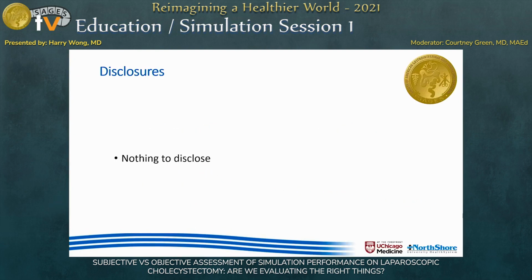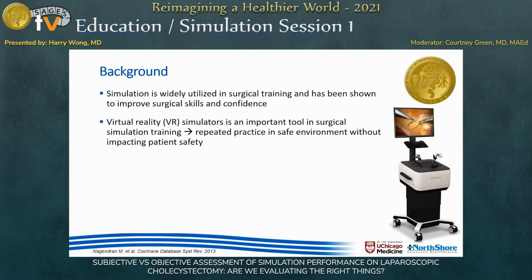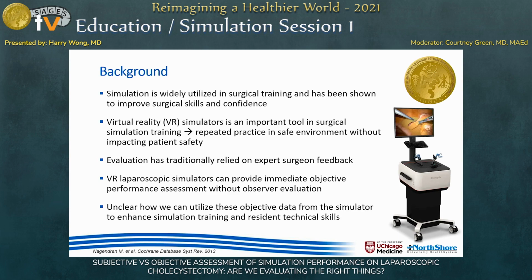I have no disclosures. Simulation is widely utilized in surgical training and has been shown to improve surgical skills and confidence. Virtual reality simulators are an important tool in simulation training, especially for trainees, as they allow repeated practice in a safe environment. While traditionally evaluation has relied on expert surgeon feedback, with these VR simulators we actually get a lot of immediate objective performance assessment without observer evaluation. However, it's unclear how we can utilize these objective metrics from the simulation modules to enhance simulation training and resident technical skills.